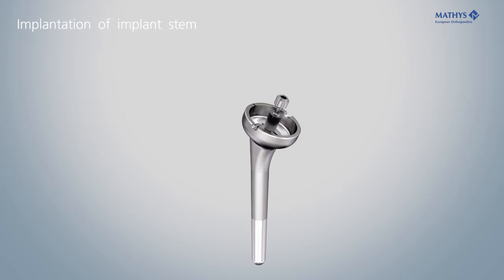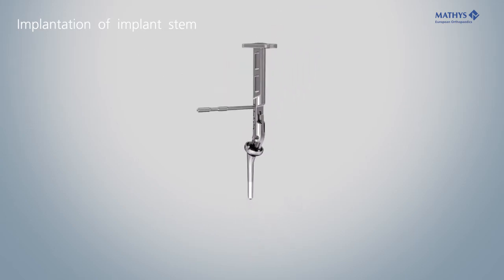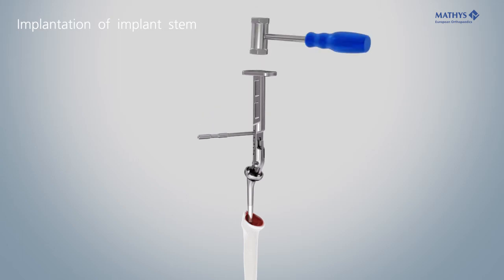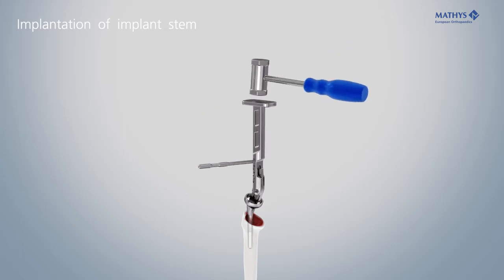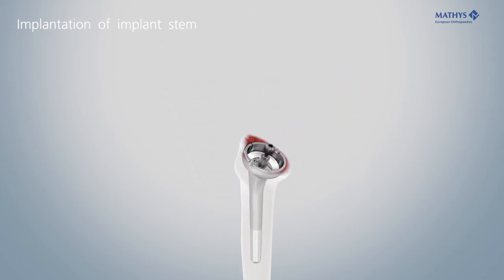Screw the guiding bolt onto the appropriate inverse stem or a trial stem. Lock the stem firmly into the positioner and insert it into the humerus. Remove the positioner and the guiding bolt. Use a cover disc to protect the humeral resection surface and the implant during preparation of the glenoid.